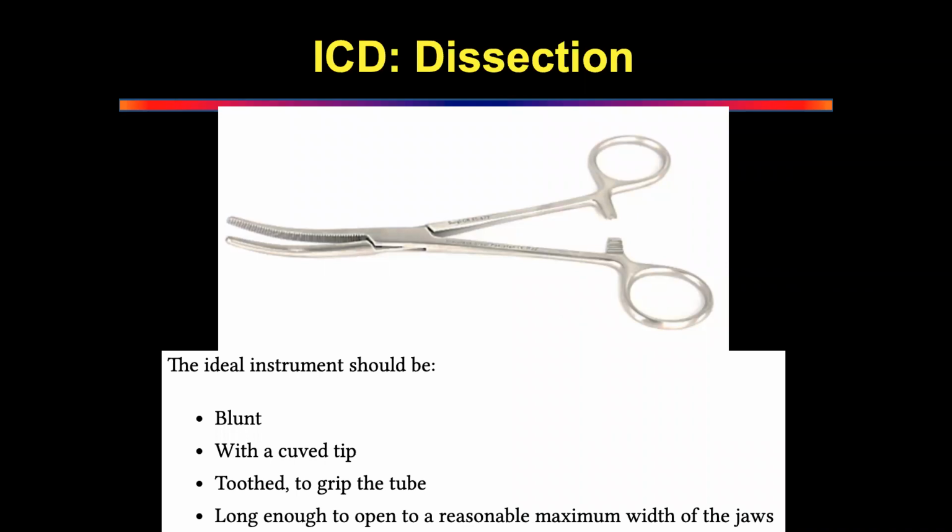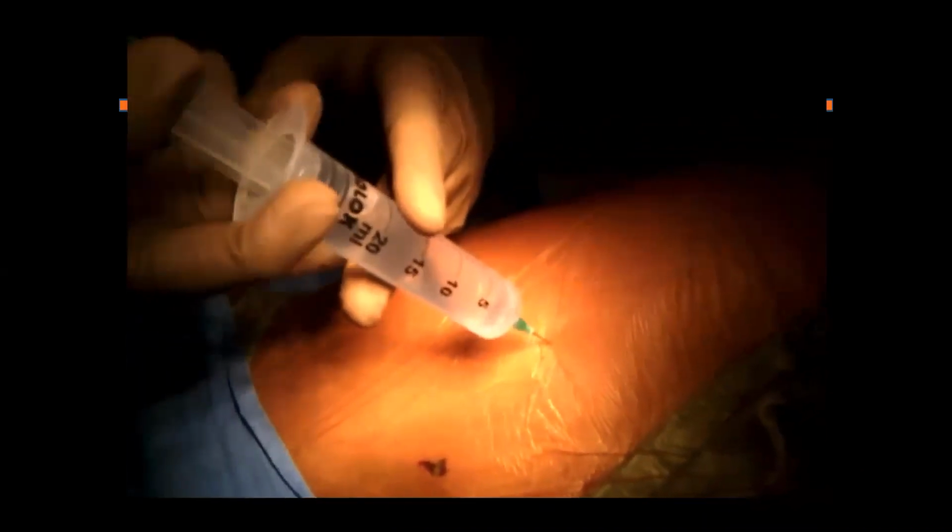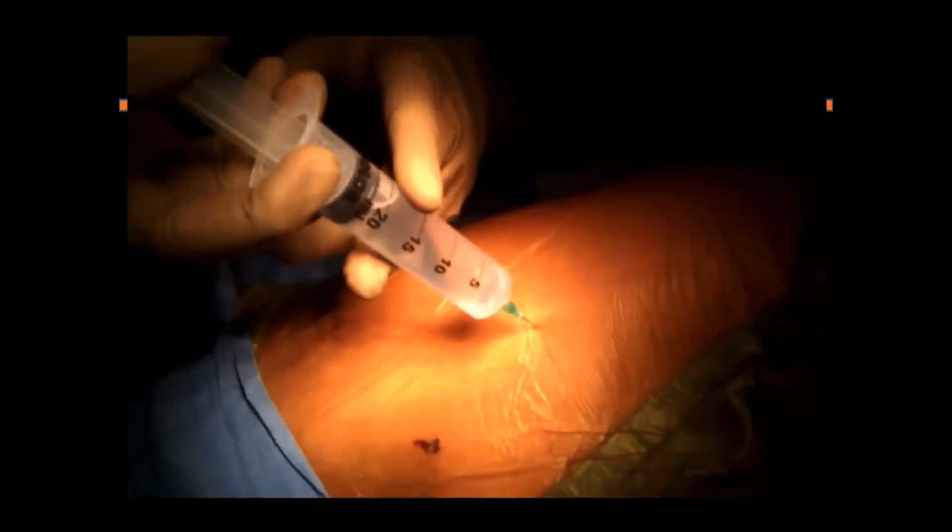Okay. So I don't mind whatever technique you want to describe, it's okay with me. This is actually a VATS procedure, but this is the same technique of giving local anesthetic. You have to aspirate as you go in and then just come out and make sure that you're injecting in the intercostal space. But when you inject, you have to aspirate before you inject.